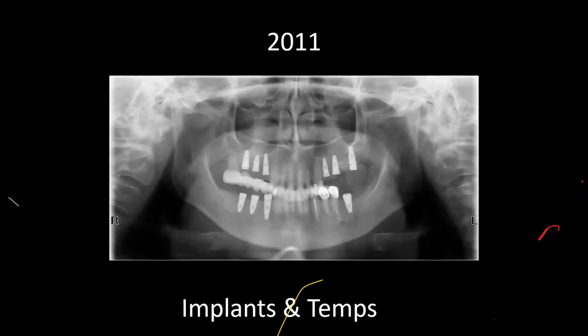Once I'm really happy with the provisional stage, this will be transferred to the articulator and then further copied and improved on in the restored design when we construct the definitive restorations in the upper and lower arches of this patient. Now, I haven't replaced the existing crowns on 3.4 and 3.5. We decided to leave the lower arch for the time being because of financial constraints, but nevertheless we can give her a functional occlusion, which eventually becomes a habitual occlusion, which is a therapeutic occlusion.